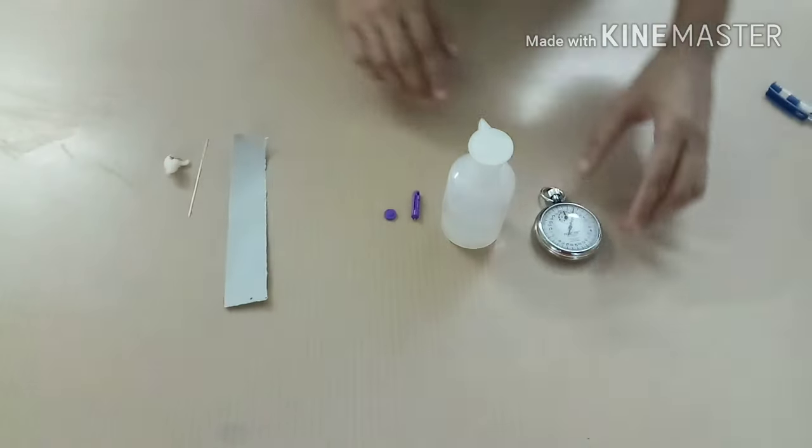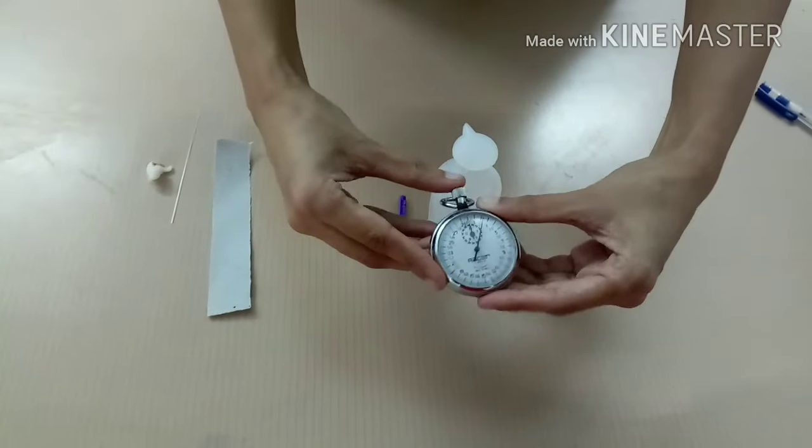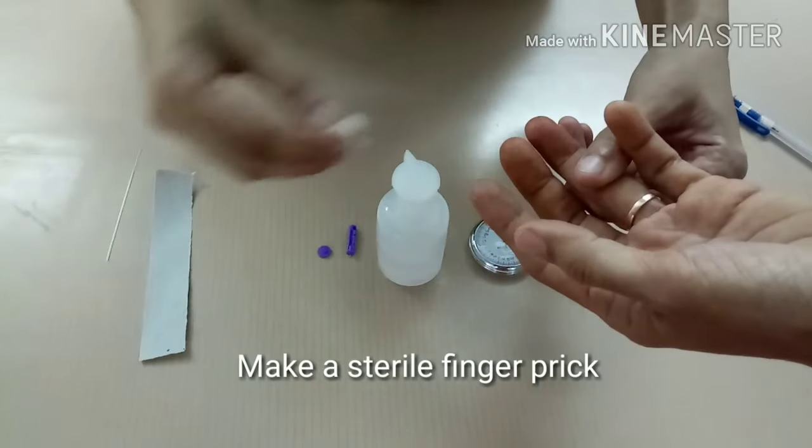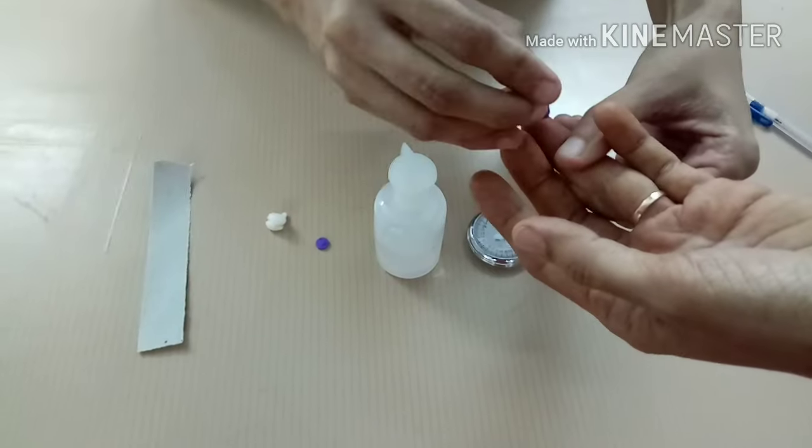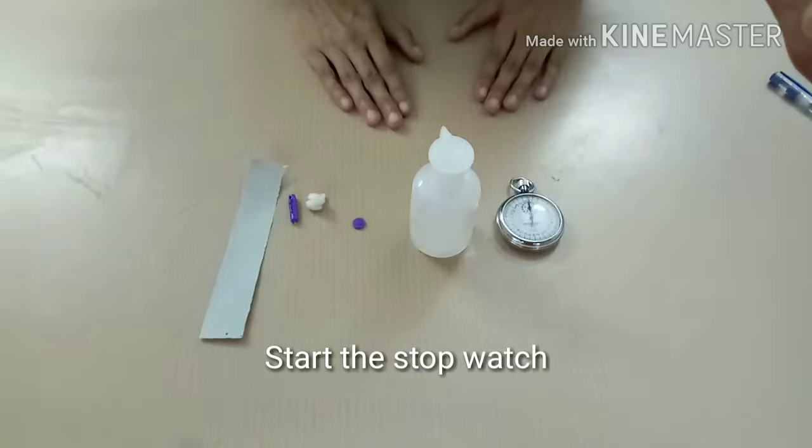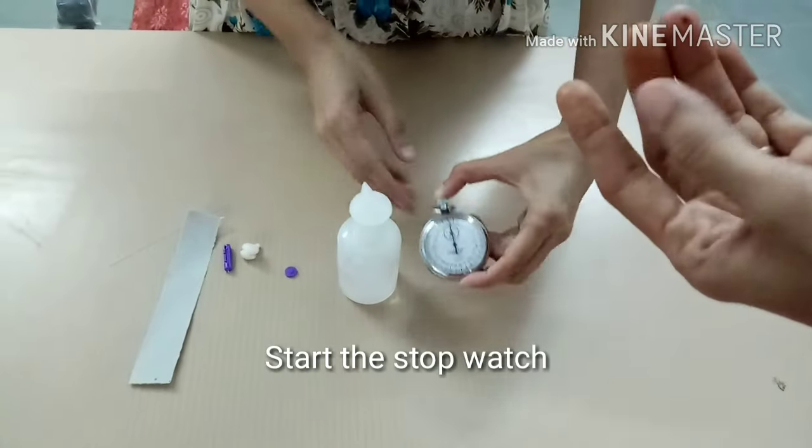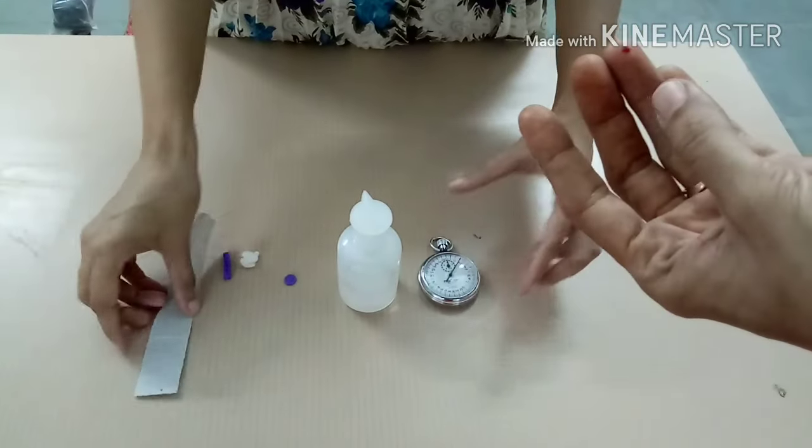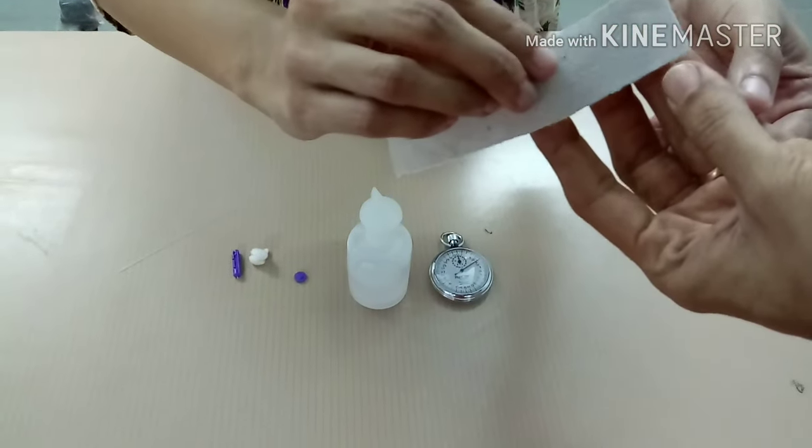Procedure. Set the stopwatch at zero. Make a sterile finger prick about 3-4 mm deep which allows free flow of blood. Immediately start stopwatch and note the time. Apply a filter paper on pricking side. It is zero time.